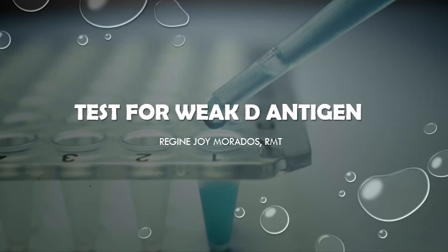Well, the answer is no. You will not report it as Rh negative directly. You should test it for weak D antigen or DU first. Why? This will be our lesson for this week. Test for weak D antigen.